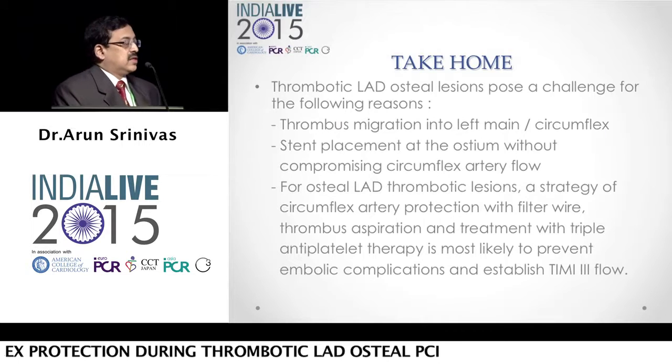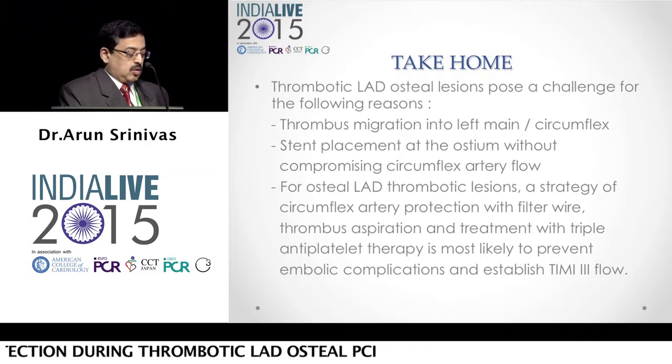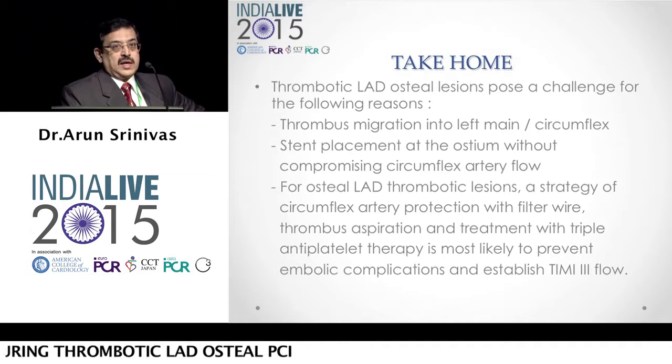Now, just a few things why we normally do this is, over the many years, whenever there is a thrombotic total occlusion of the osteal-LAD artery, we have seen a few cases where thrombus migration or embolism of the circumflex artery can be catastrophic.